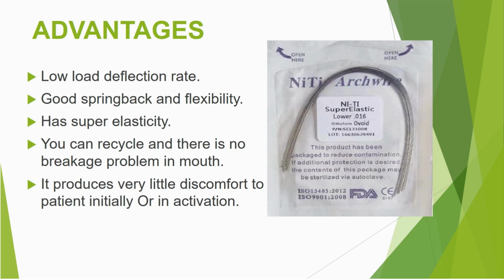Advantages of nitinol wire. They have low load deflection rate, good spring back and flexibility, have superelasticity, you can recycle them, and there is no breakage problem in the mouth. It produces very little discomfort to the patient initially or in activation.